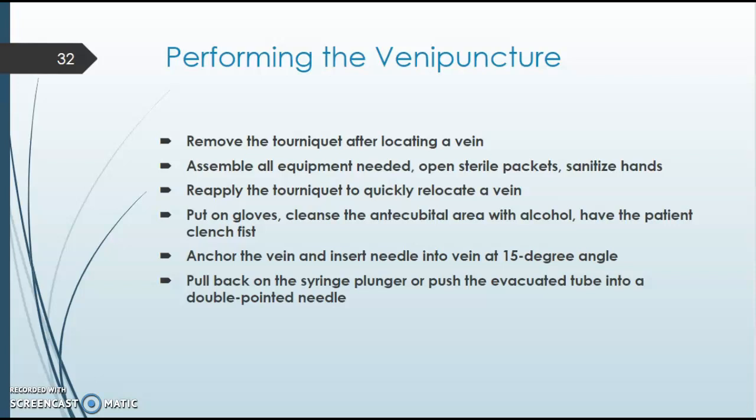Then once you have everything set up, you will reapply the tourniquet, put your gloves on, cleanse the area, and have the patient make a fist. You then anchor the vein and insert the needle at a certain degree depending on what type of needle you use. Typically it's a 15-degree angle.